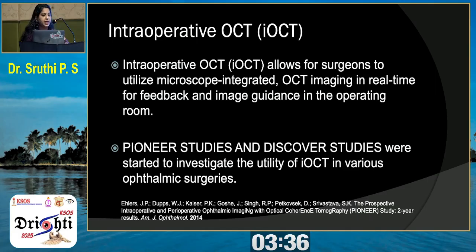Coming to the next, intraoperative OCT, that is IOCT. Intraoperative OCT allows the surgeon to utilize a microscope integrated OCT imaging in real time for feedback and image guidance in the operating room. Two major studies are underway, the PIONEER study and the DISCOVER study, to investigate the utility of IOCT in various ophthalmic surgeries.